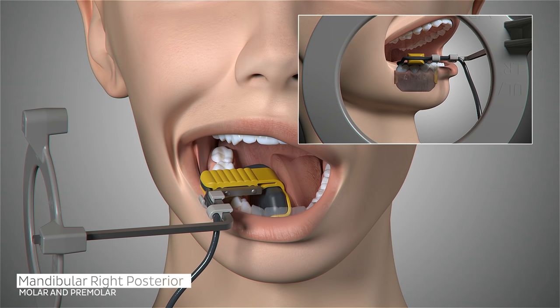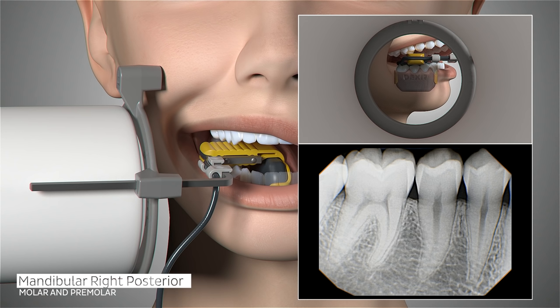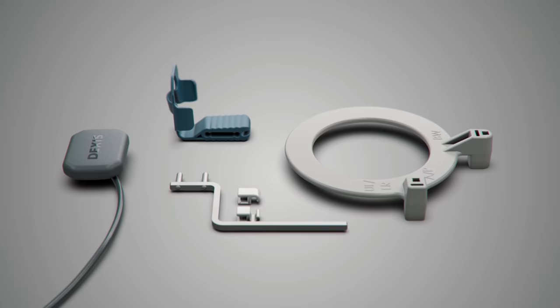Ask the patient to open slightly and gently slide the sensor forward, centering the first and second premolars on the sensor. Slide the aiming ring as close to the patient's jaw as possible. Position the cone of the x-ray emitter and trigger your exposure. The image should contain the distal of the canine through the mesial of the second molar.